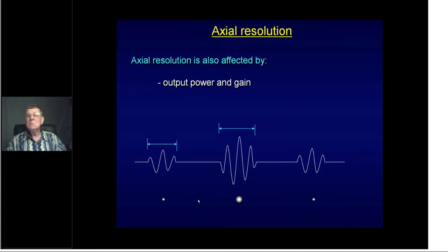If you put it in terms of the brightness of the dot you get on the screen, I think it becomes probably a little bit more logical. Here's your little tiny dot of light caused from the echo in the patient. Here is the amplified one more, it's much stronger, and therefore the dot of light's going to be larger, it's going to be brighter. And you can see it's wider, and therefore it would merge in with the next one beside it faster, and therefore the resolution will be worse. So spatial pulse length is going to be affected by those two.